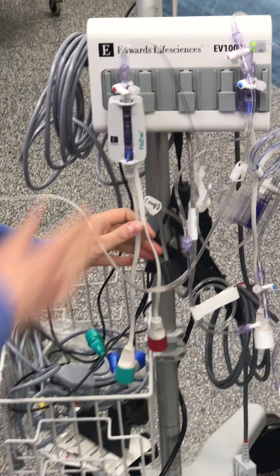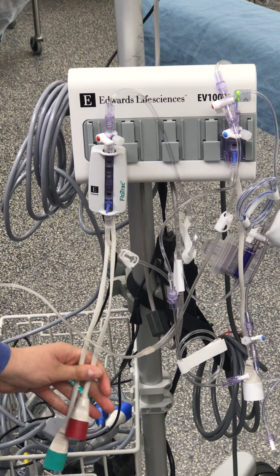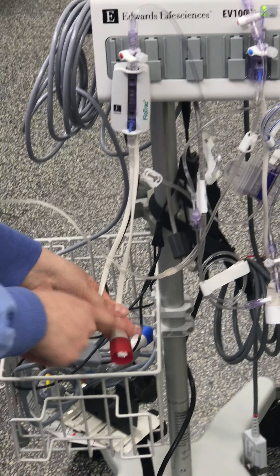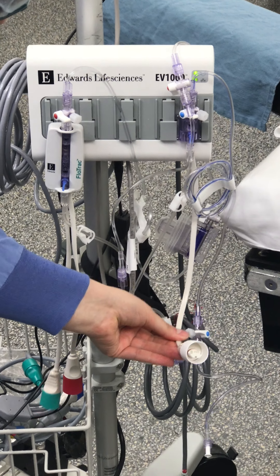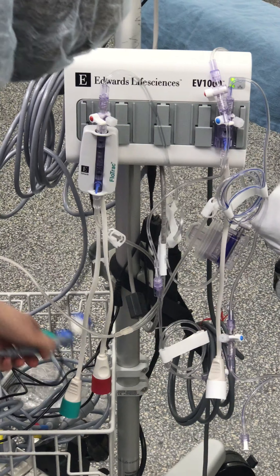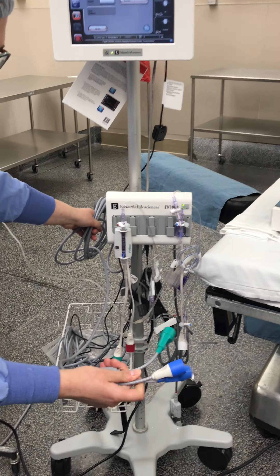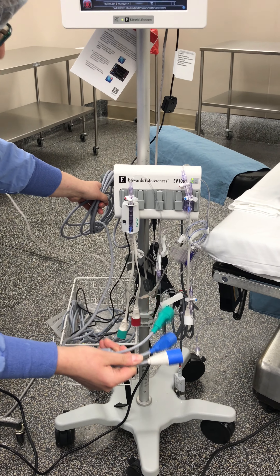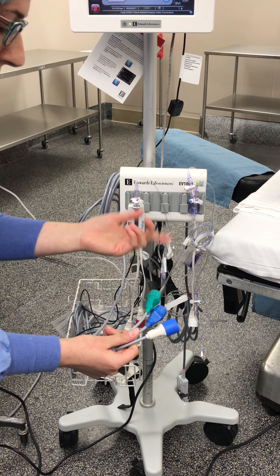First I want to show you guys how to hook up the cords. Olivia primed our lines here for us earlier. We've got the flow track here on this side with two cable cords — the red one and the green one. And then we've got our CVP over here on this side, and it's just got a white cord. This traveling machine has a three-headed cable attached to it. It comes with one green and two blue cords, so it's color coded.